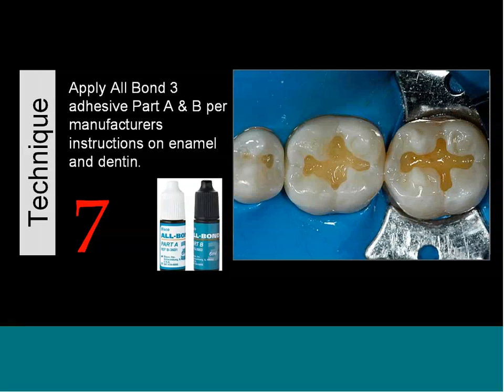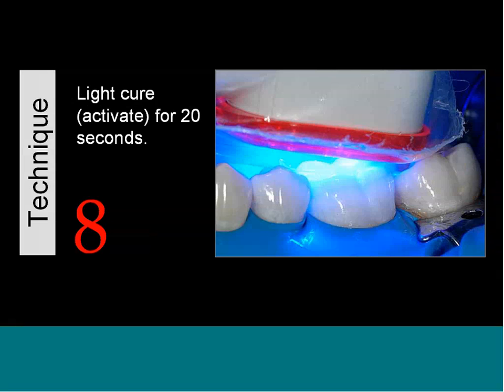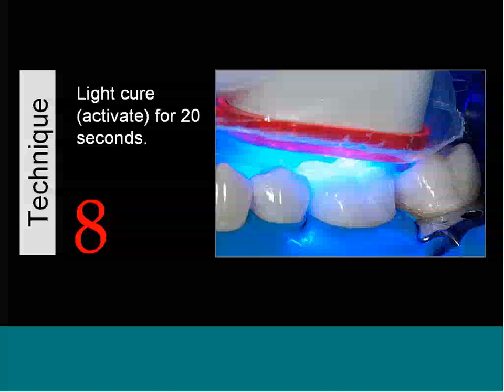And then there we go. When that's done, you have a nice shiny appearance. And then you want to light cure or light activate that for 20 seconds.